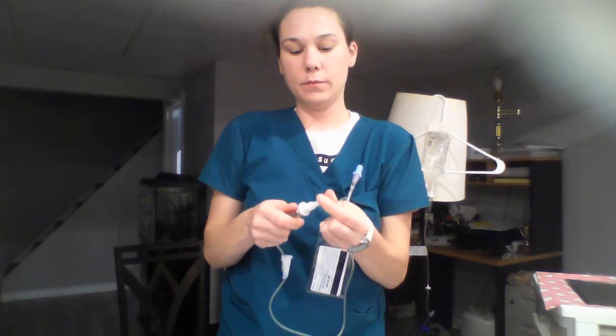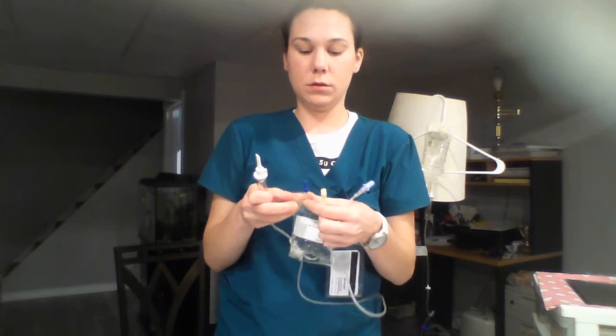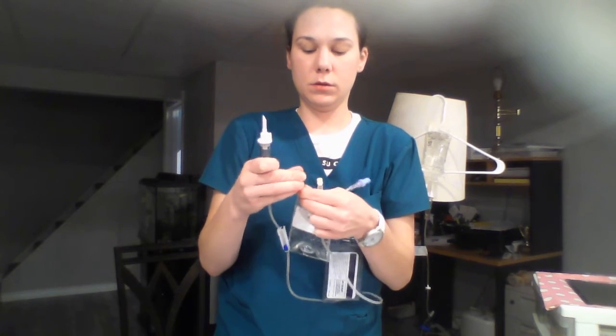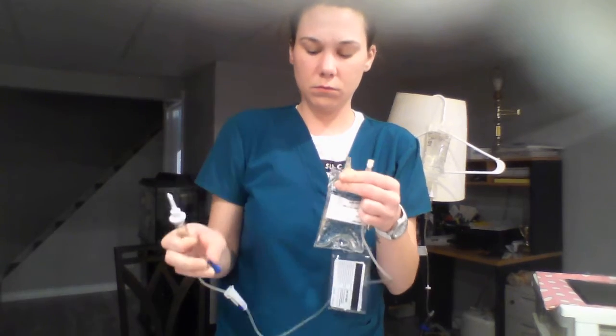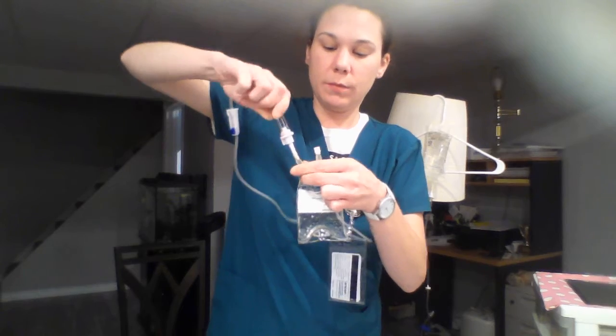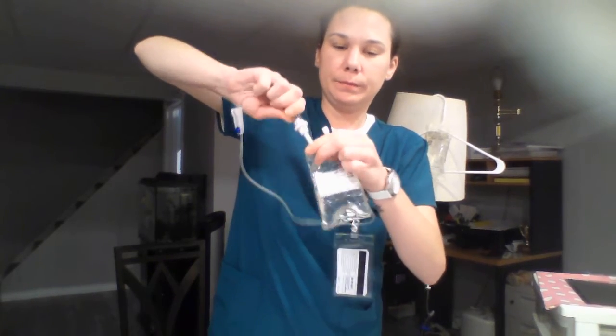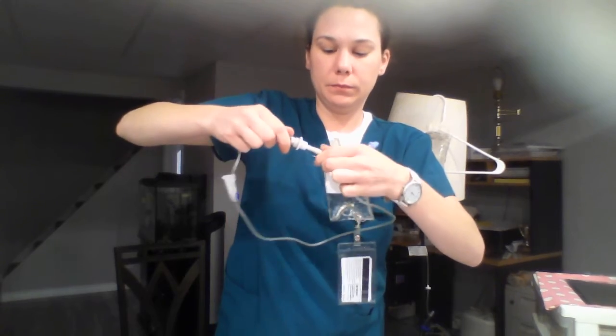So maintaining sterile asepsis. Going to undo that. I'm going to spike my bag. Okay.